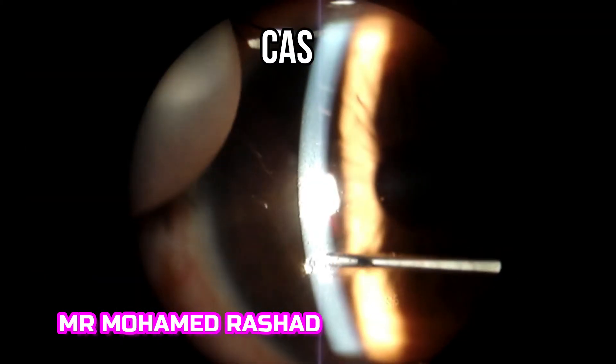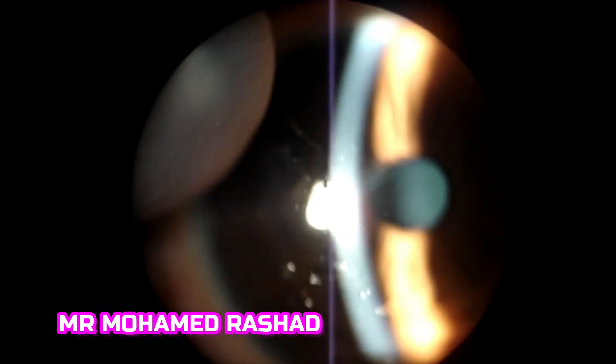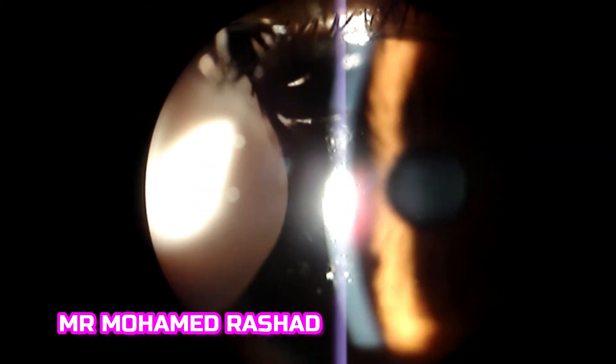Make sure you are focused. In this first case, you simply dislodge the metallic foreign body with the needle. Once it is dislodged, that is enough. This is the metallic foreign body and this is the rust ring, shown with retroillumination. We can then try to remove the rust ring.